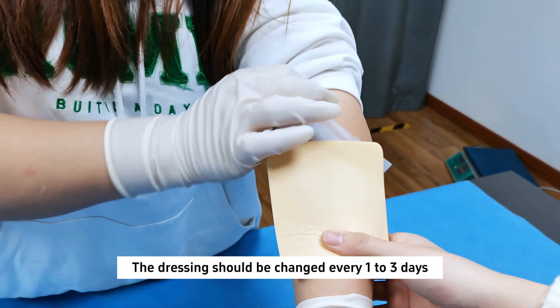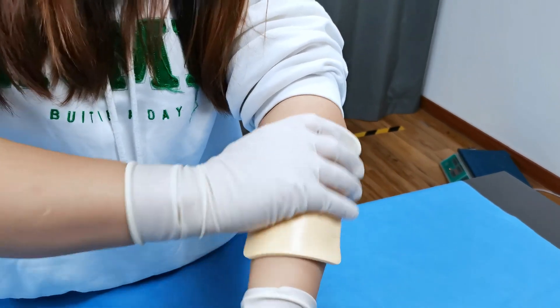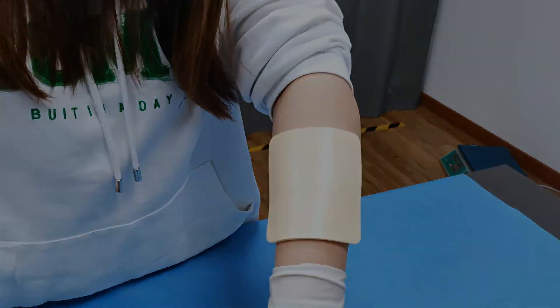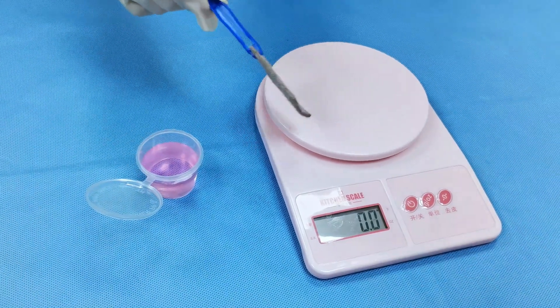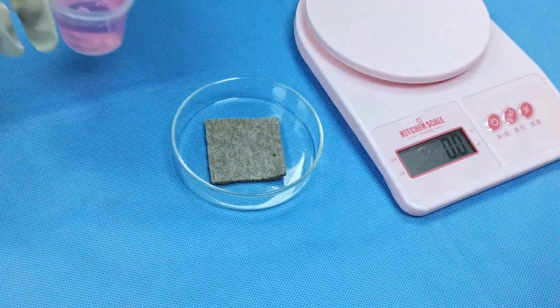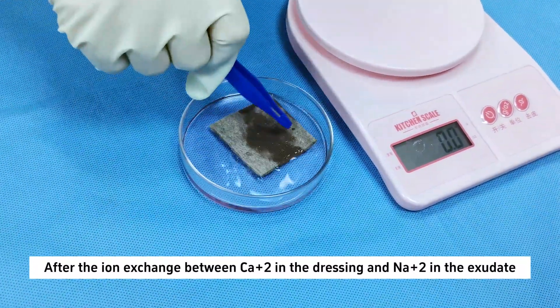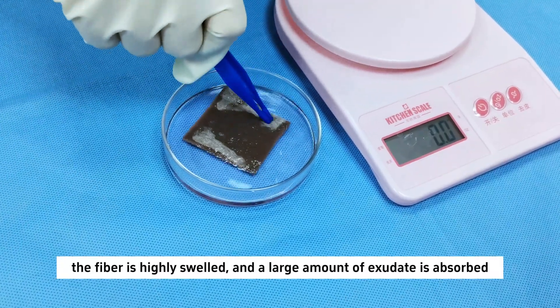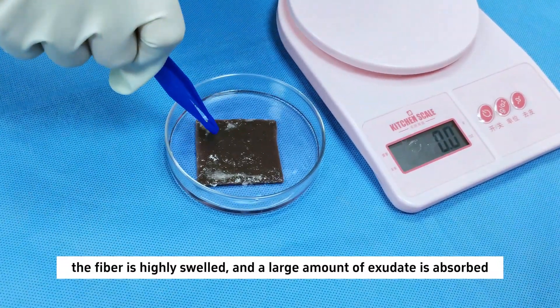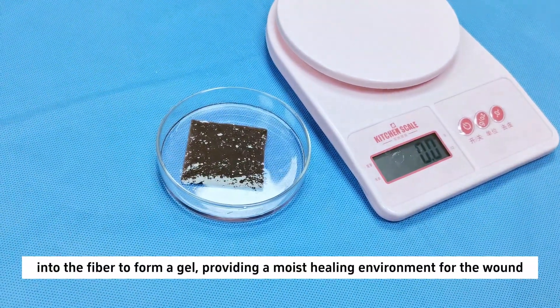The dressing should be changed every one to three days.